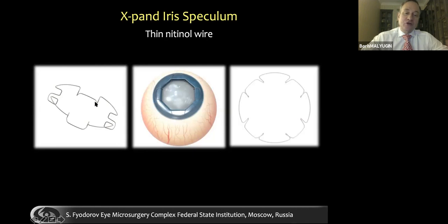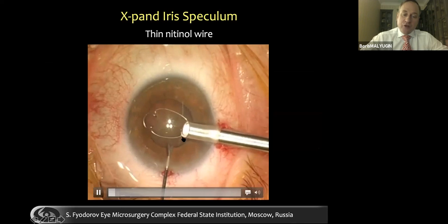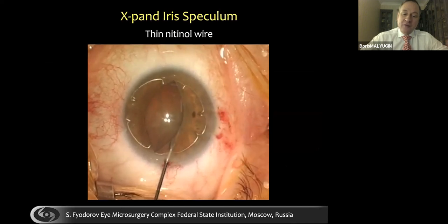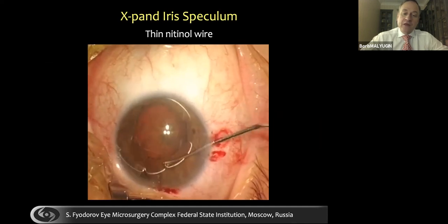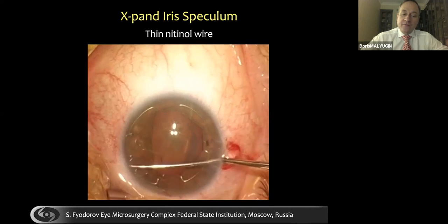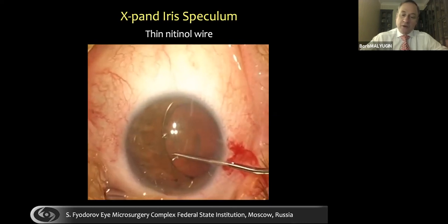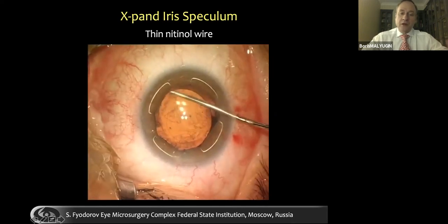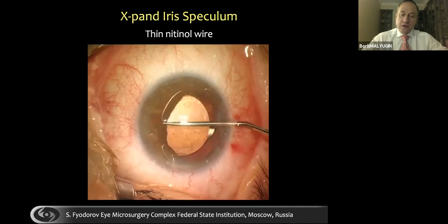This is the three-dimensional structure that is used with the special insertion device, as shown here, and it is now injected inside the anterior chamber, and the instrument, such as a fork-shaped spatula, is used to catch the iris with the fixation element of that device, and as a result, we have a 7 millimeter square, almost round pupil, and you see how this device can be removed from the eye in a manner opposite to what you've just seen in the previous video clip.